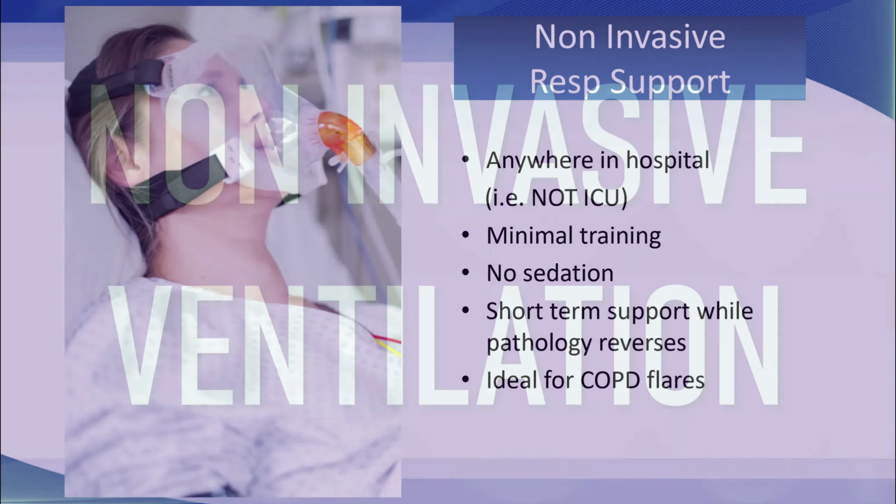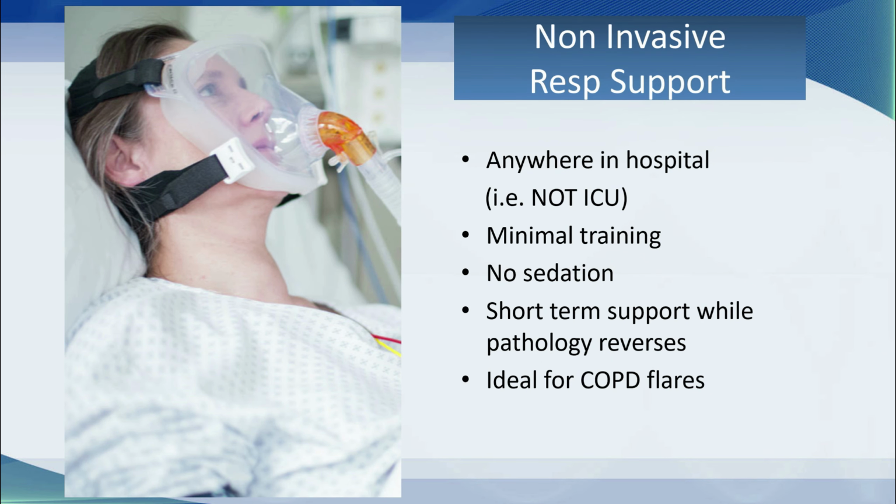Let's move on to non-invasive ventilation. Non-invasive respiratory support was one of the great innovations of the last 30 years. It can be delivered anywhere in the hospital, so the patient doesn't have to be in ICU, and particularly in healthcare systems where very few ICU beds are available, it allows doctors and nurses to care for patients who need respiratory assistance at remote locations.